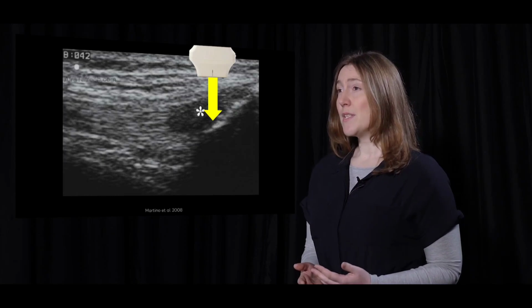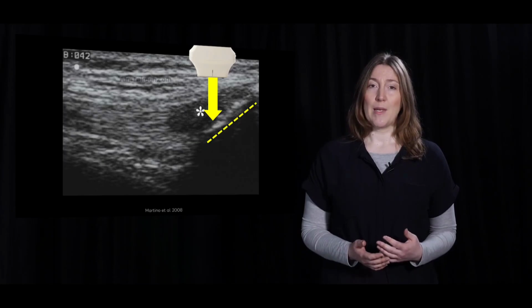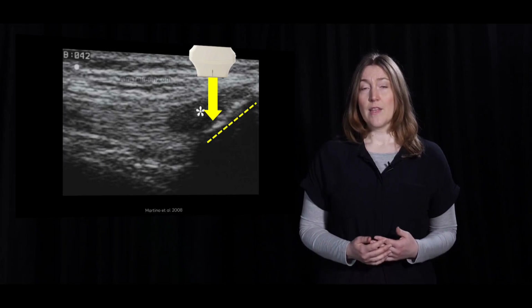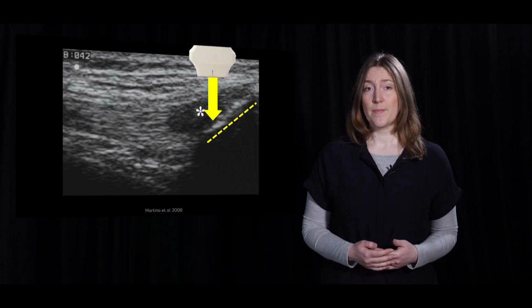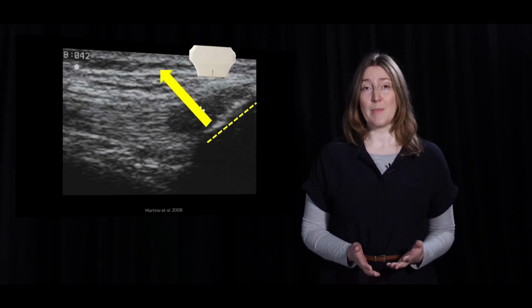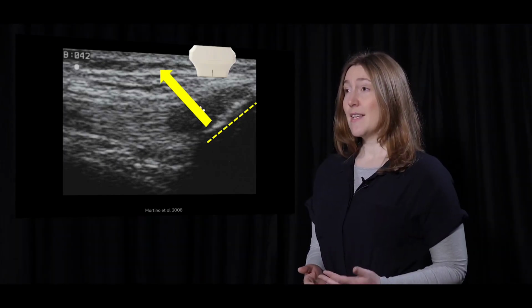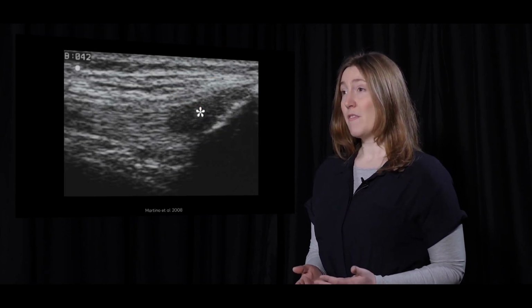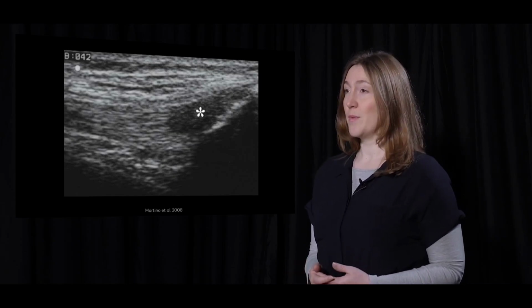The transducer produces the ultrasound beam which travels through various soft tissue layers. The ultrasound beam hits the patella bone, which in this case has an oblique orientation. The ultrasound beam does not hit the bone perpendicularly due to the angle of the patella bone. The result is that the ultrasound beam is not being reflected back to the transducer, but reflected away from the transducer. The angle of incidence is the same as the angle of reflection. The result is that, partly due to the unreflecting ultrasound beam, some information misses. The ultrasound does not see this zone.